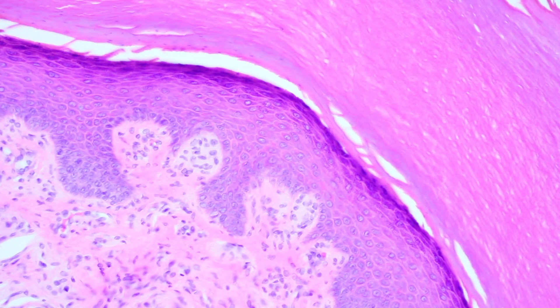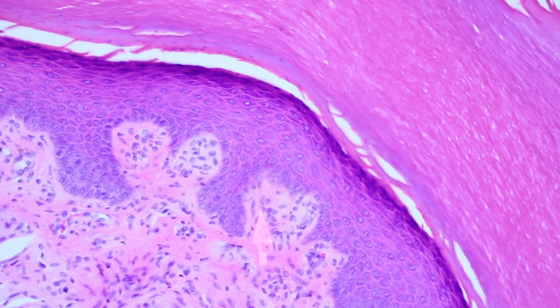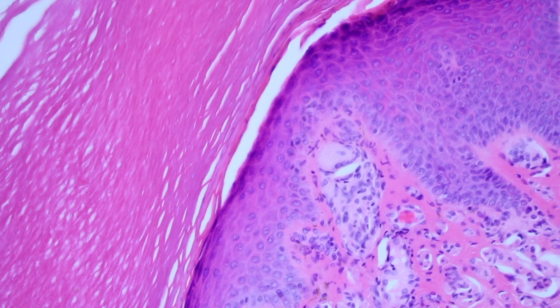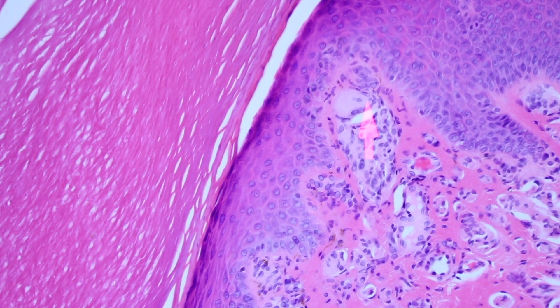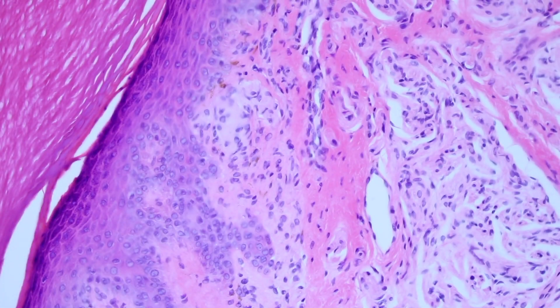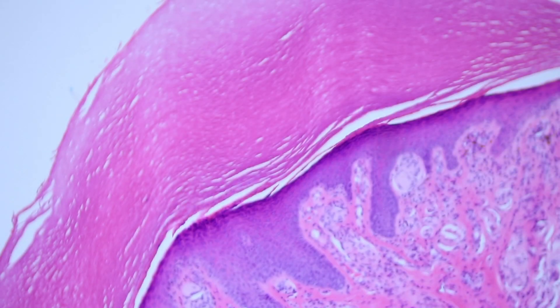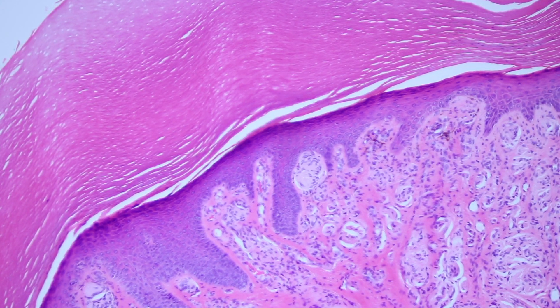There are quite a few of them — there's a Meissner's corpuscle, and there's another one there. These are just normal histologic structures, but they're actually important because when you see them, it gives you an idea that you're probably on palm or sole, even if no one's told you that. We also see things that look kind of like Meissner's corpuscles in some tumors, particularly diffuse neurofibromas — we call those Wagner-Meissner bodies. You can see similar structures in neurotized nevi. It's good to recognize normal histology because sometimes tumors try to recapitulate normal histologic structures.